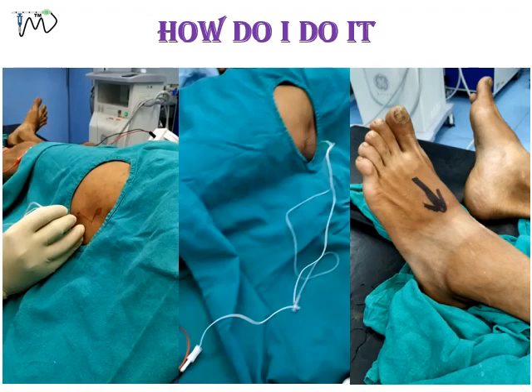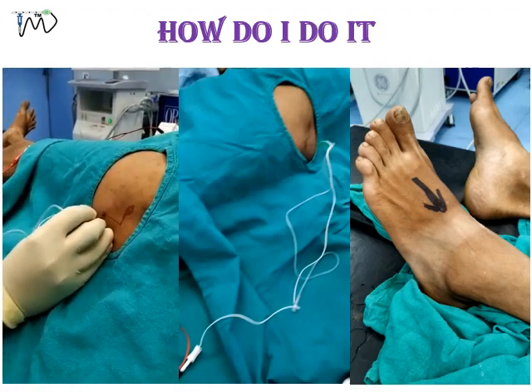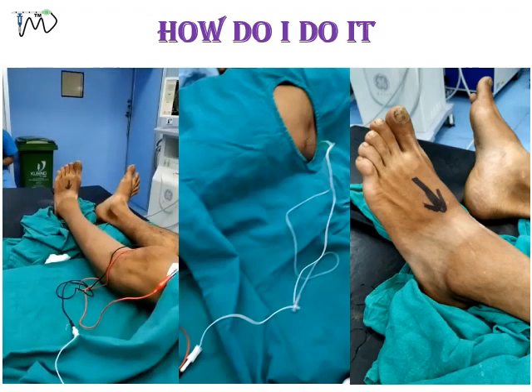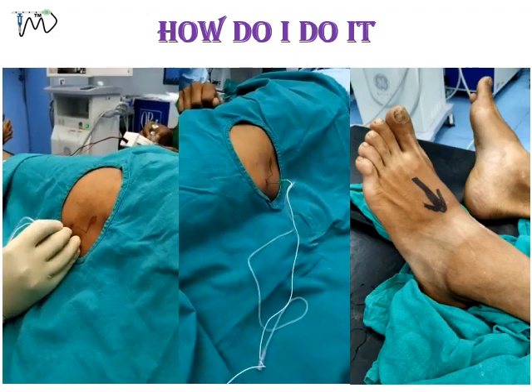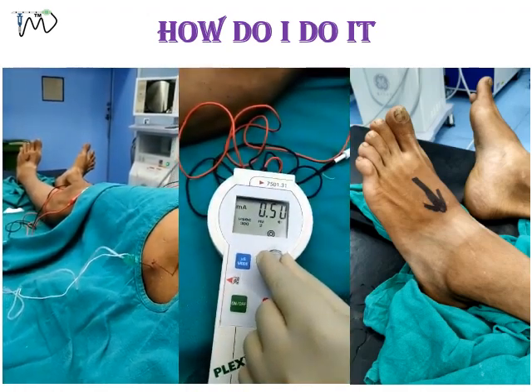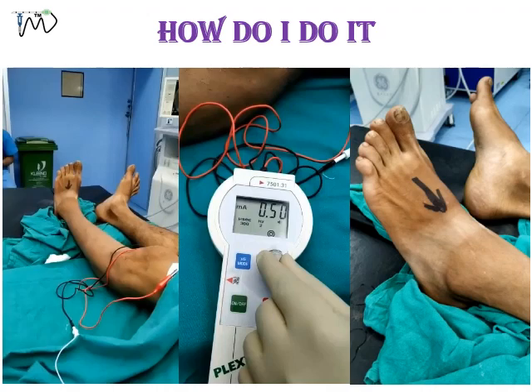Let's watch a video on Gardini's subtrochanteric approach. Here you can see I have already inserted the needle and am doing some fine tuning to get the response. This is the eversion response from stimulation of the common peroneal component. Once you get the response, you do some fine tuning and get the response at a lower current. I am getting this response around 0.5 mA, decreasing to 0.3 to 0.4 mA, and then you can go ahead with the injection.